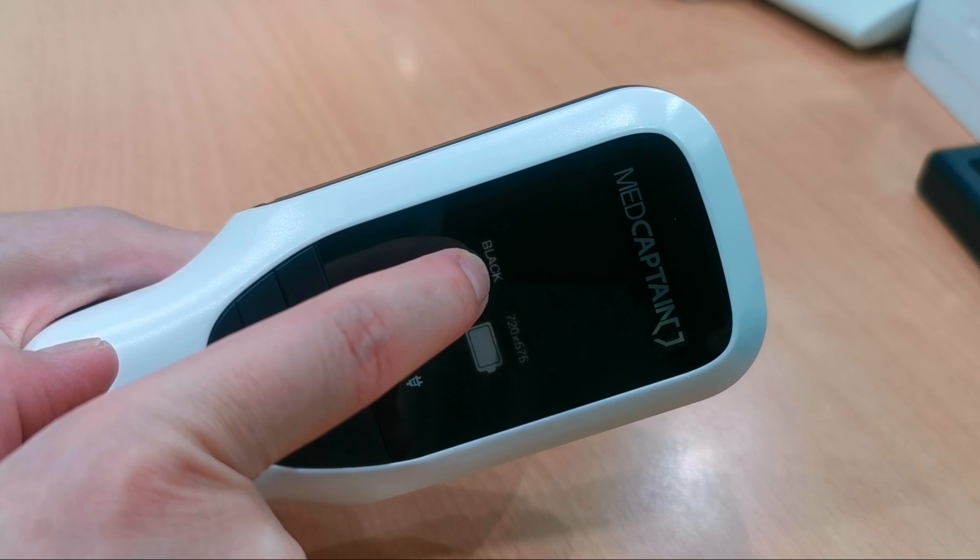Now let's move on to the mode button. When you press the mode button, the color of the display changes — you can see green, red, purple, and blue. There is also a monochrome mode, which is black and white. When you press the mode button, the vein color changes from white to black.